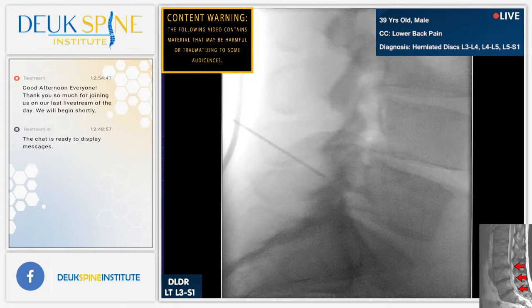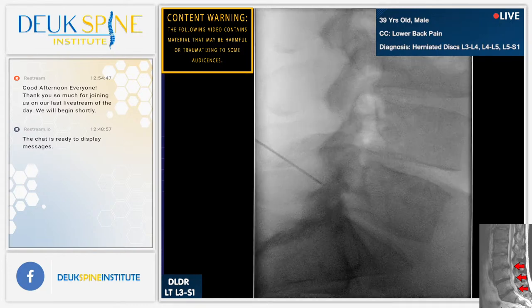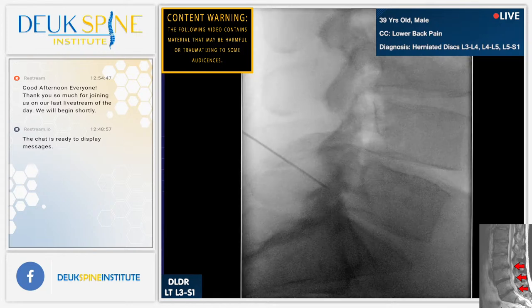That's better. Looks a little overexposed in the back. Doesn't look very crisp and clear. Any reason why, Jordan, that would be the case? I can look through some things here, see if that changes. Let's do that. Shot. All right, so I'm aiming for the, that's too much of the blocking out. Shot. That's better. Yeah, try to get that optimized before I come in with the anesthesiologist. Shot. Those are all things that you guys are capable of doing on your own without my involvement. Shot.